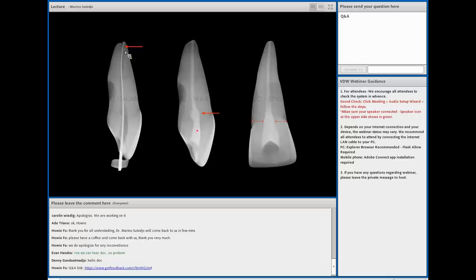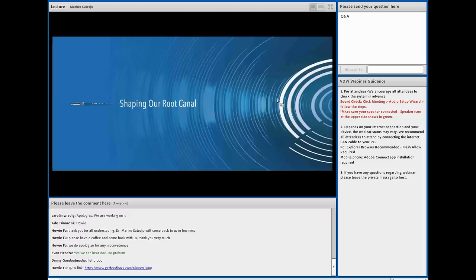And this is the outline form of the maxillary central incisor, as you can see. We still can do a conservative access cavity without forgetting the enlargement, and we can still gain apical control without any coronal interference at the coronal portions, and we still can maintain our pericervical dentin in a good way, as small as practical.